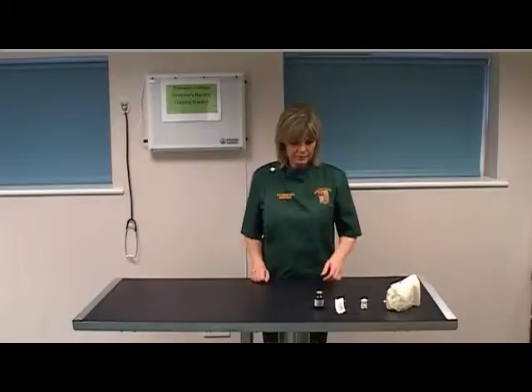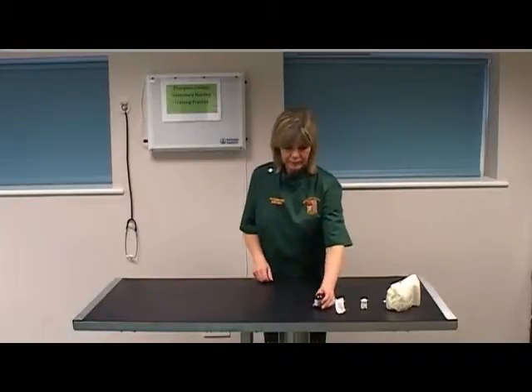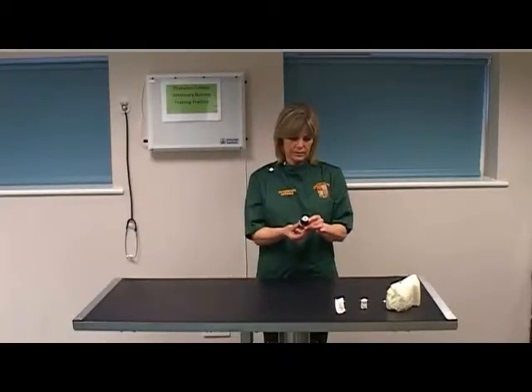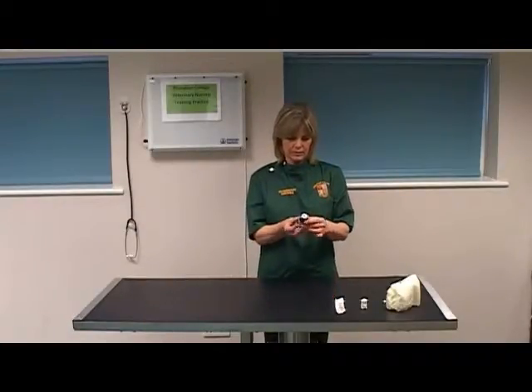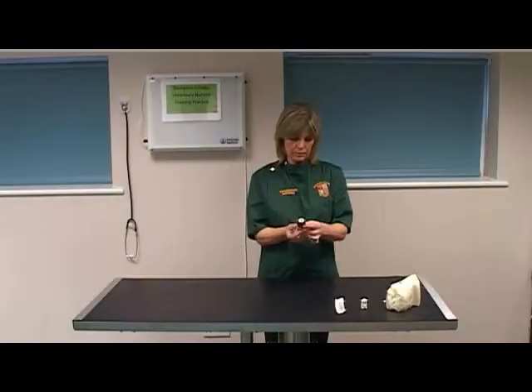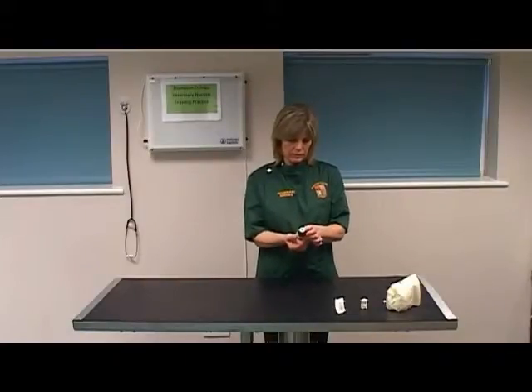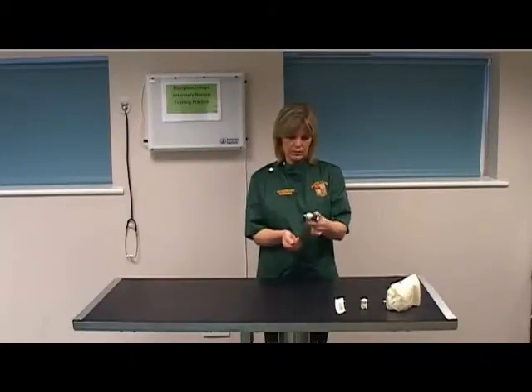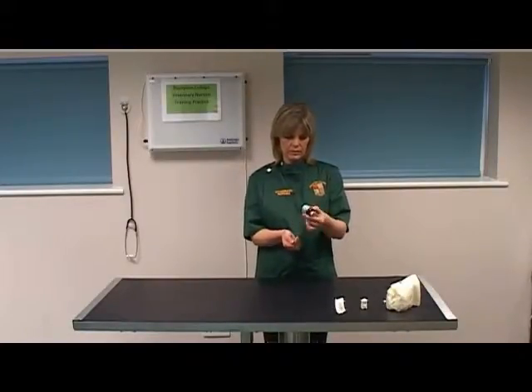Select the correct insulin vial, check the expiry date and date of first opening. Gently invert the vial several times to mix the contents.